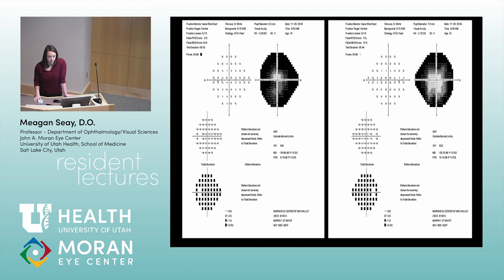So what do you guys think about these visual fields? How would you approach this patient at this point, given these visual fields? Her main complaints were blurry vision at distance, double at near. It wasn't, I can't see anymore. I think with a 15-year-old girl who underwent a traumatic event, you always have to keep in mind functional vision loss. Do a tangent screen. Yeah. So tell me about the tangent screen. What do you do with that?